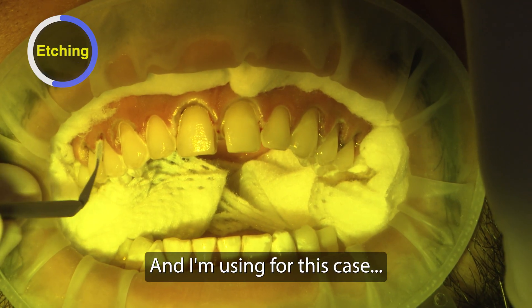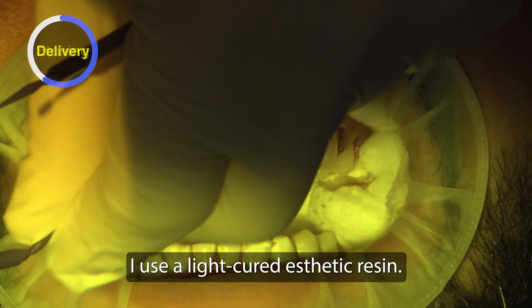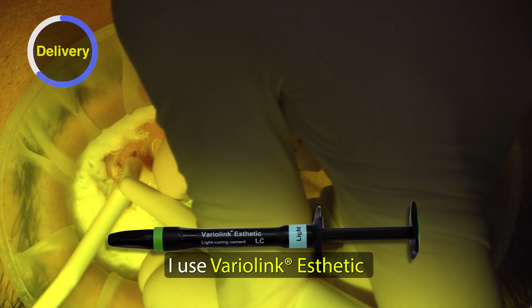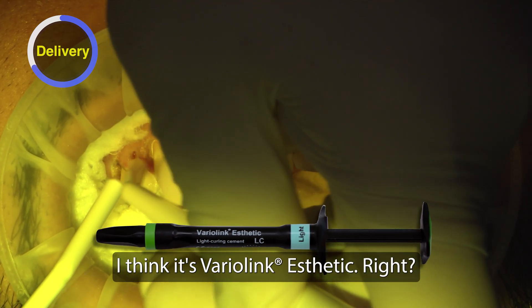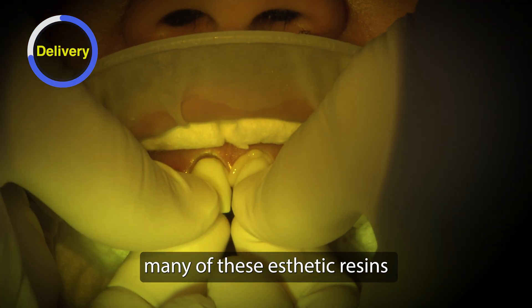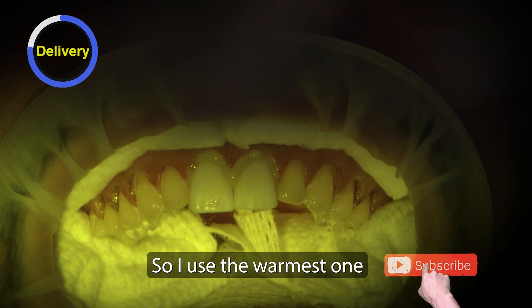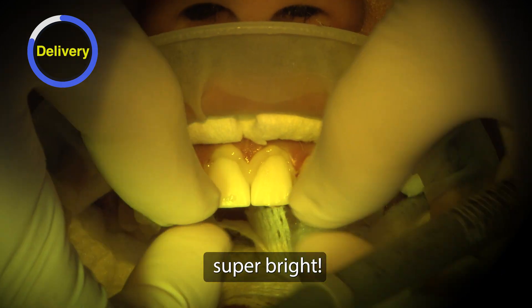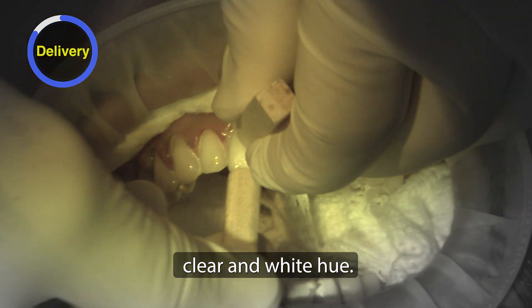For all veneer cases I use a light-cured aesthetic resin. For this case I use Varialink Aesthetic — or Varialink Veneer — with a warm plus chroma. Many of these aesthetic resins come in different chromas. I use the warmest one because this bleach shade is super bright and I wanted a little warmth coming through. Usually I use a mixture of clear and white.